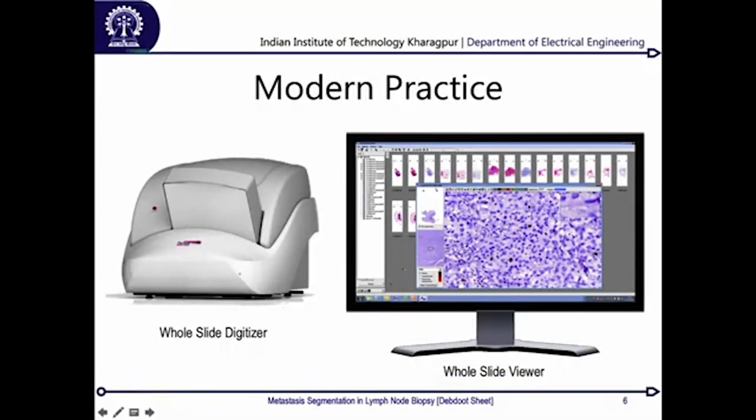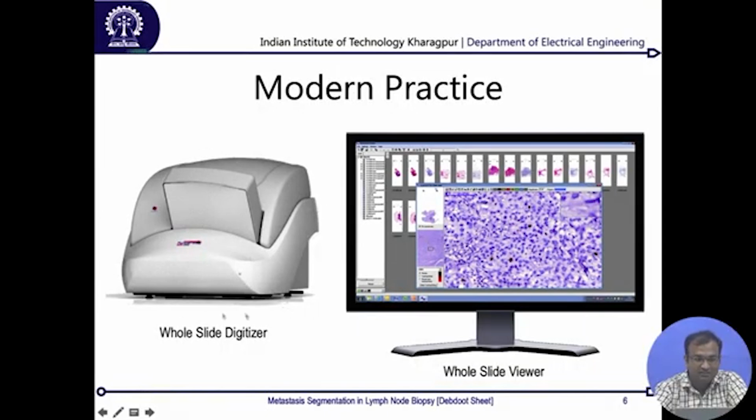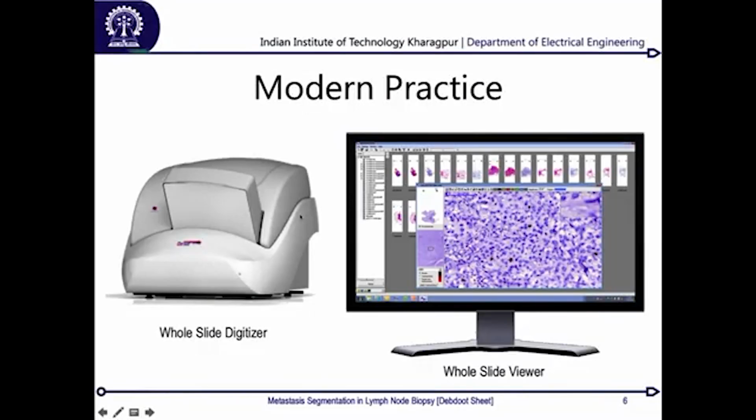Now in modern practice, for these histologies as well, we have a similar option, which is something called a whole slide imager or a whole slide digitizer. You take that complete slide and mount it onto a cartridge over here. There is basically a robotic microscope inside this box, which takes an image of one portion and then slides the slide by a few millimeters, or whatever resolution you need, and then takes another. So you basically have a tile of such images created.